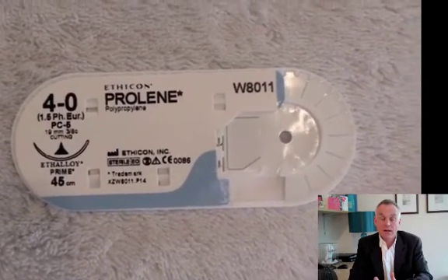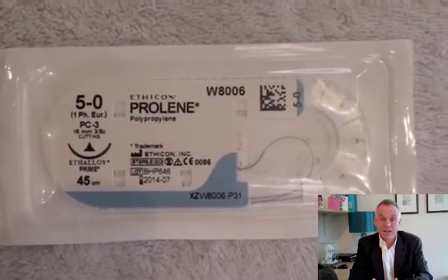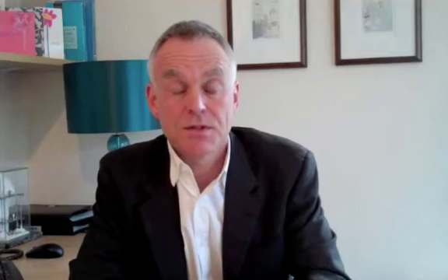You can use Ethylon, which is black — that's nylon — but it doesn't slip quite as easily through the skin, so I don't use that. There are other alternatives such as Novafil, but I think good old fashioned Prolene is the best non-absorbable suture for me. The biggest I would ever use is 4.0, with 5.0 and 6.0 being my most common sizes. I use 6.0 normally on the face, in really cosmetically important areas.